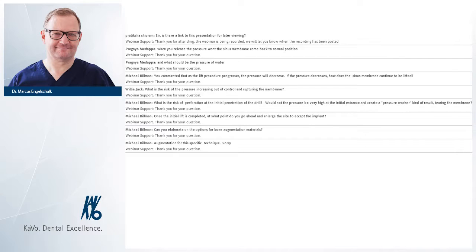And the first drill you use by your choice would be the drill for the implant. Because as I already mentioned, the YEDA system is not related to any implant system. So if you bring in your implant, you have to create the hole for the implant by yourself, by your implant system, and then you can use your own drills. But this is at a stage where you have already augmented and lifted the sinus floor. I hope this is explained well for you.